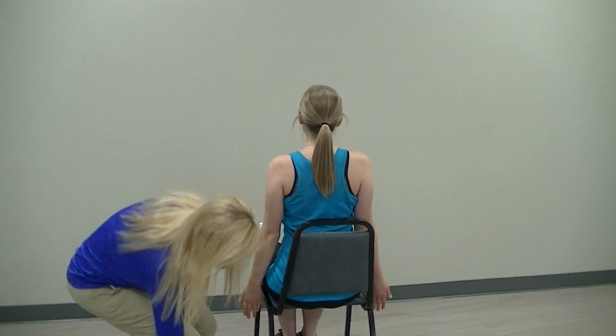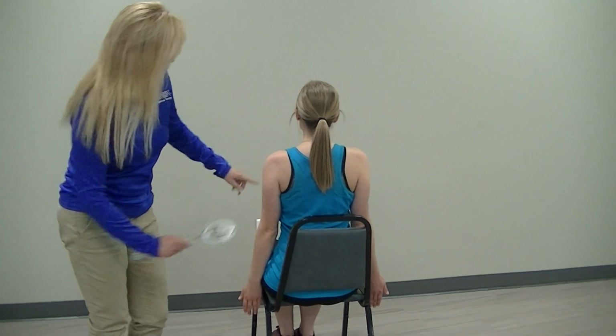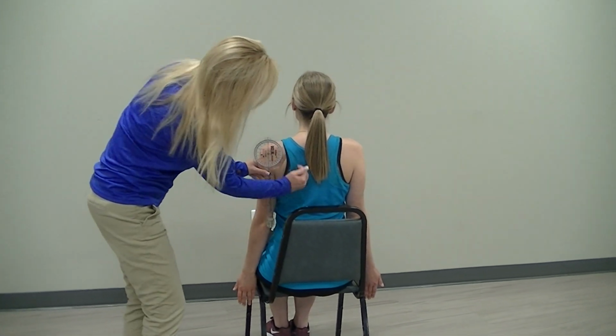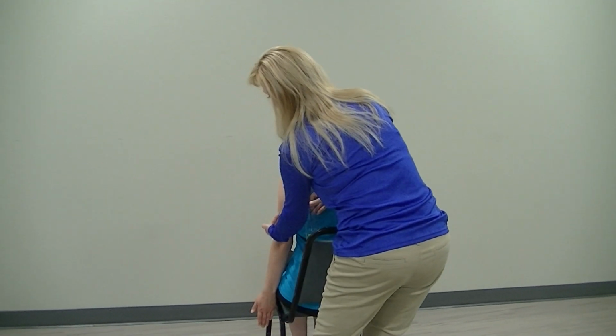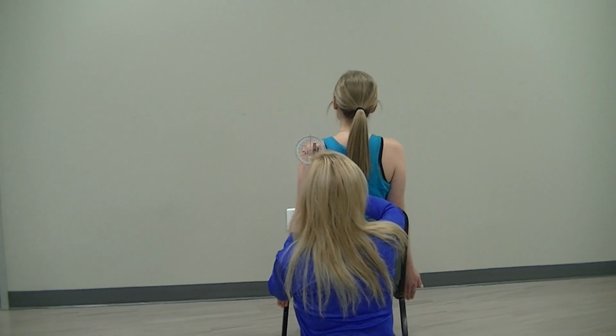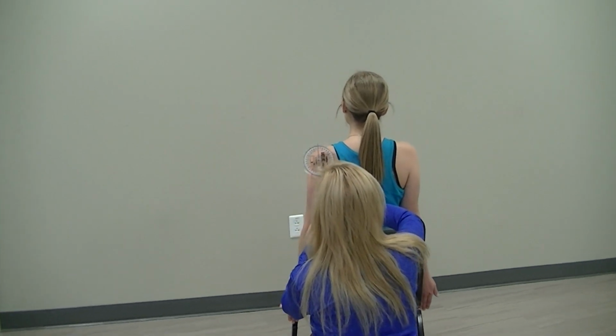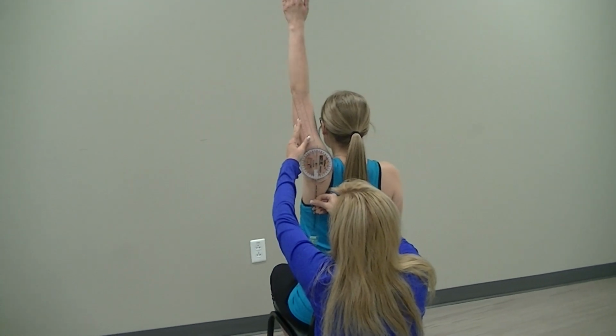To perform the measurement, the axis is centered on the posterior head of the humerus. The stationary arm is parallel to the spine, and the movable arm is along the longitudinal axis of the humerus on the posterior surface. The client is instructed to perform the movement. Ask the client if they can go any further.